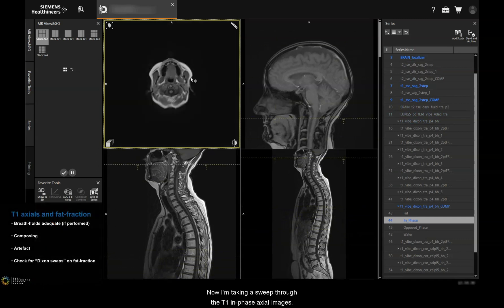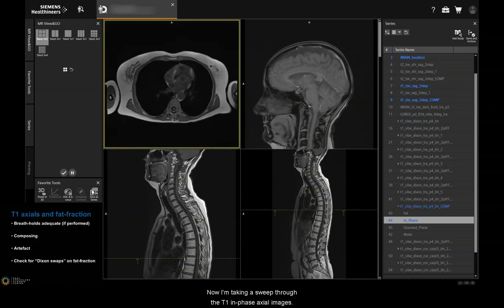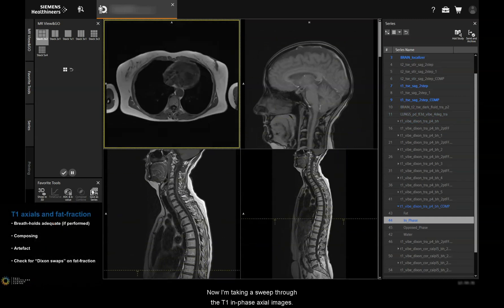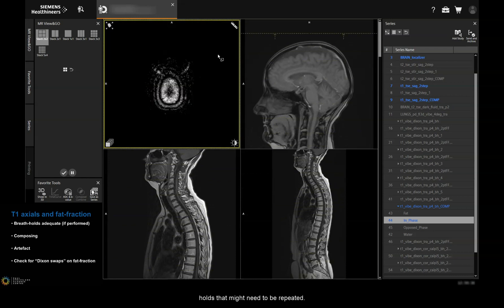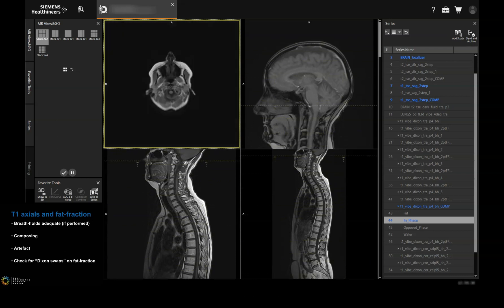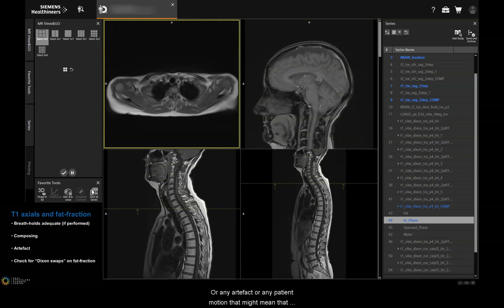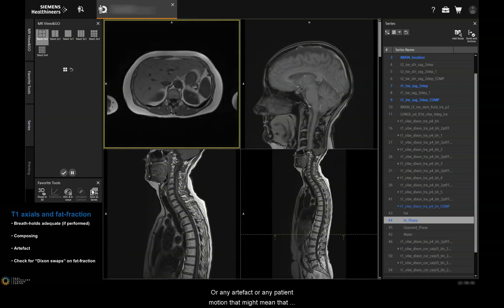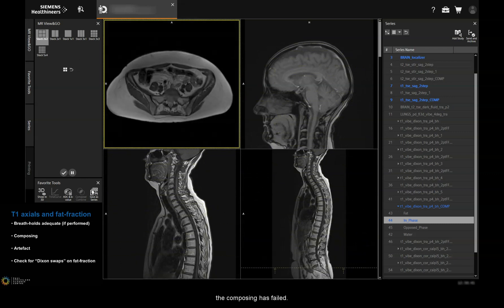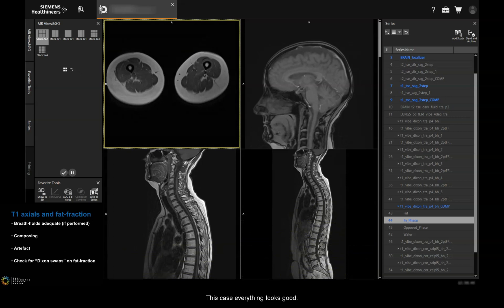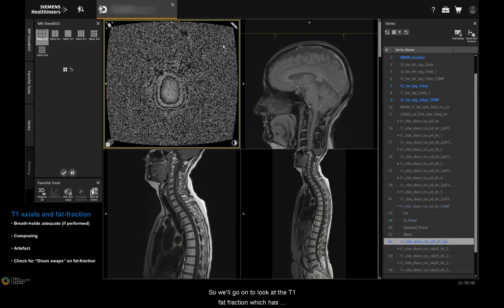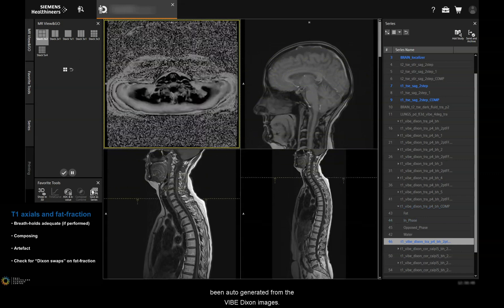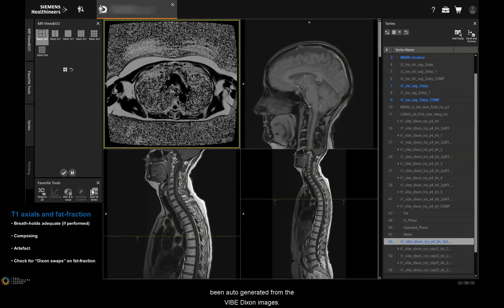Now I'm taking a sweep through the T1 in-phase axial images, looking for anything like failed breath holds that might need to be repeated, or any artifact or patient motion that might mean that the composing has failed. In this case everything looks good, so we'll go on to look at the T1 fat fraction, which has been auto-generated from the VIBE Dixon images.